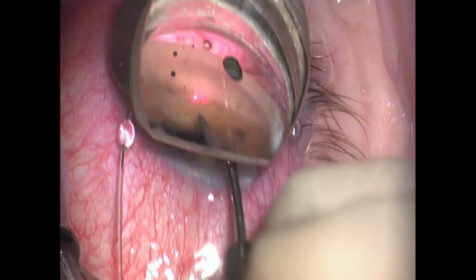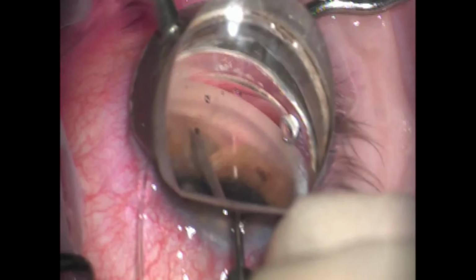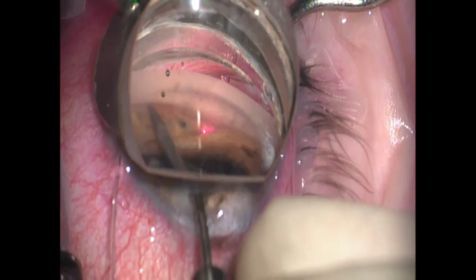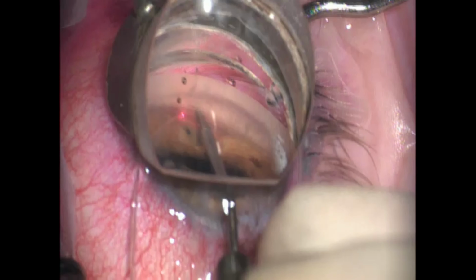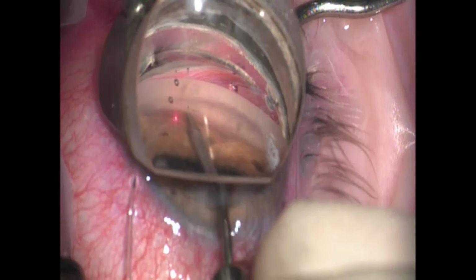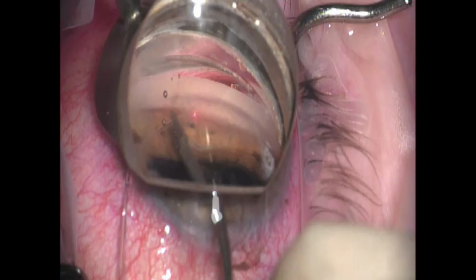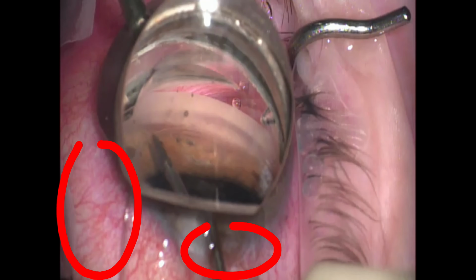The goal here is going to be to use my RPT cutting forceps to pull down the iris and open up the angle. Initially, you see no angle structures. With a little bit of downforce right near the angle itself on the iris, you can see the angle is now open. I have enough visibility and trabecular meshwork available now that I can perform a small goniotomy. That goniotomy allows me to thread this catheter through the trabecular meshwork.